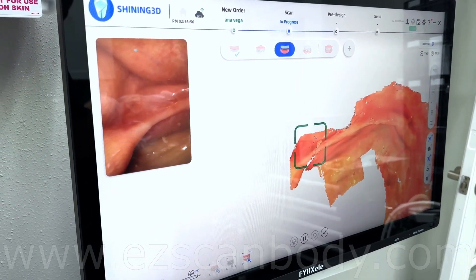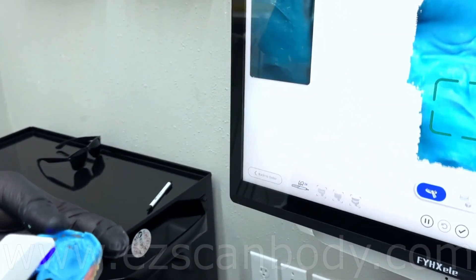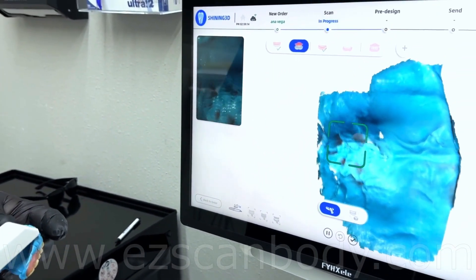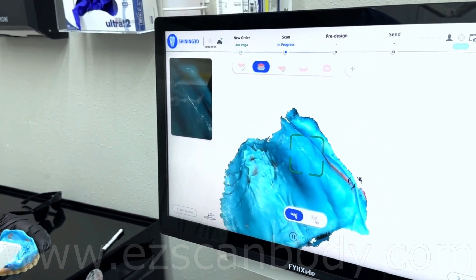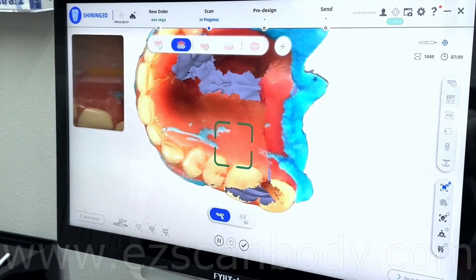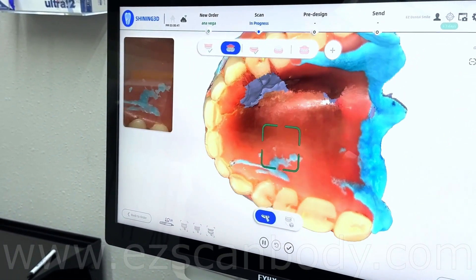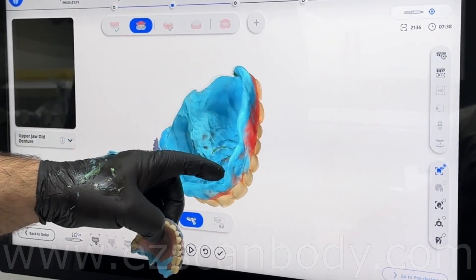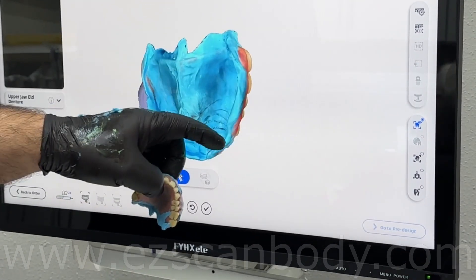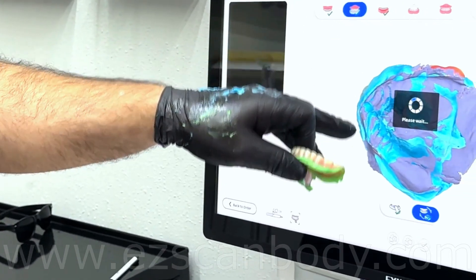You need more patience scanning the lower jaw since it is narrow and also has the tongue and muscles moving a lot. I deleted the wrong scan area and re-scanned it. I also changed the option between edentulous and all-on-X scanning because the scanner got slow due to moving muscles and saliva. Now the scanner goes to denture scanning. Always start from the intaglio to have a better scan and make sure you go continuously.